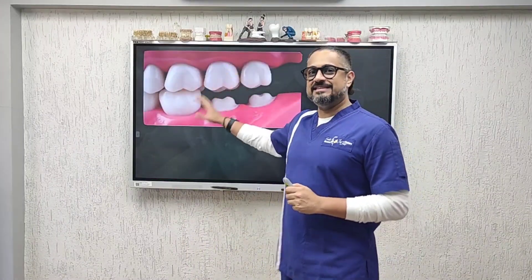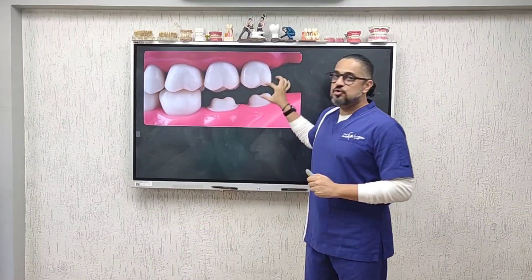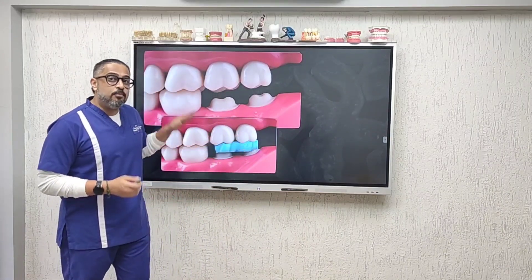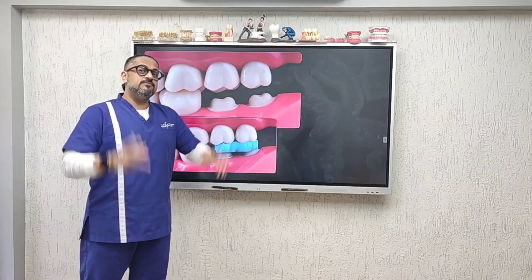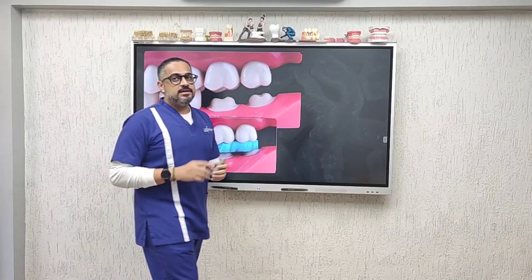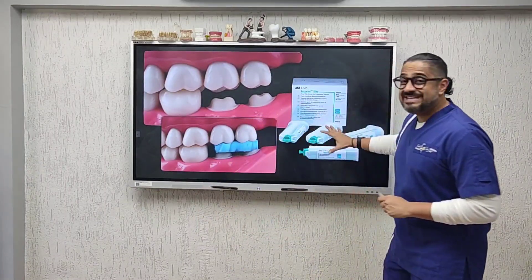Bite registration is typically indicated in scenarios like this, where a terminal molar has been prepared and the technician needs to know the amount of clearance provided. An ideal bite is only a segmental bite — one that extends over the portion of the area that has been worked upon. It should cover only the occlusal surface of the prepared terminal teeth, not the entire arch.